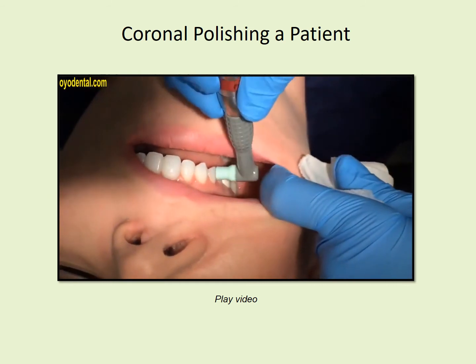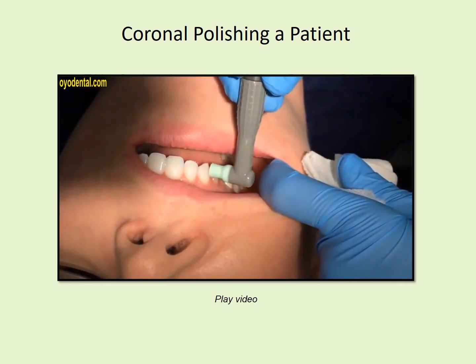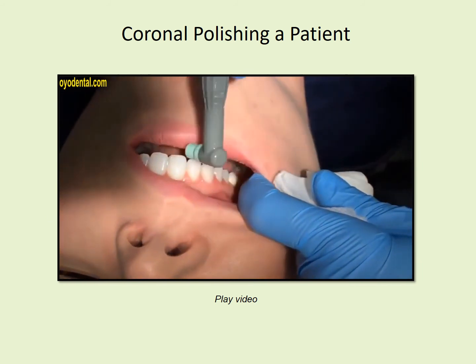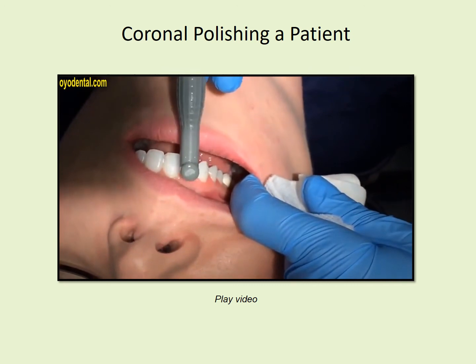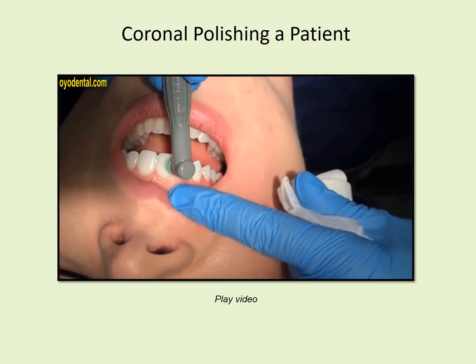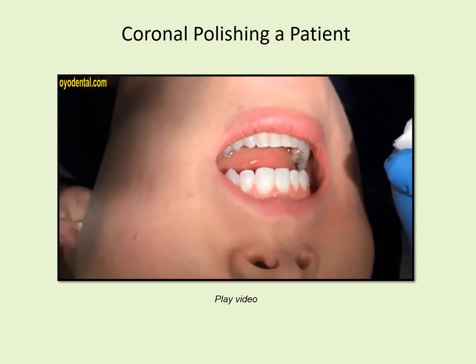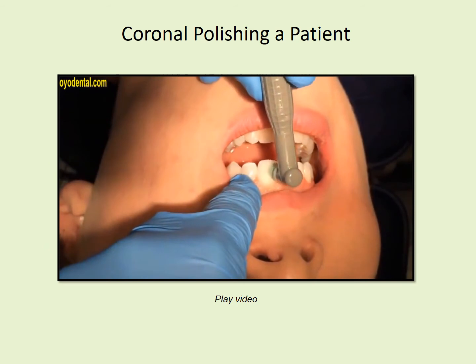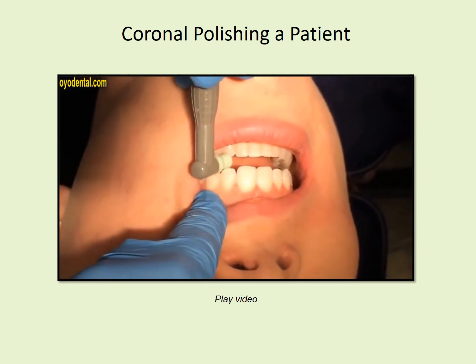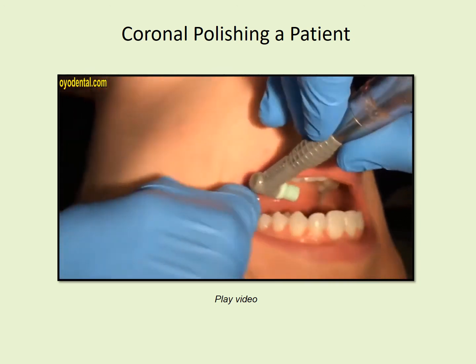Reload. And fulcruming on her chin using an extraoral fulcrum. Turn towards me. Turn more towards me. Thank you.